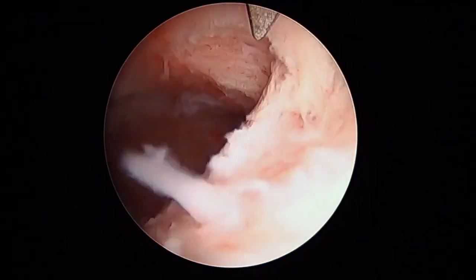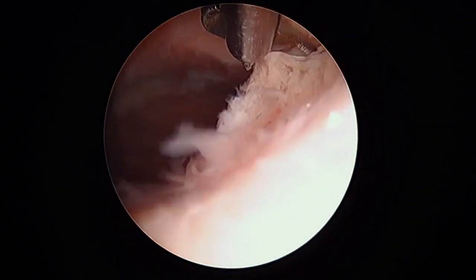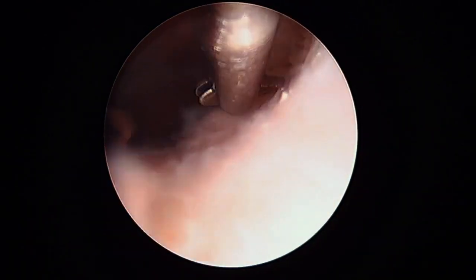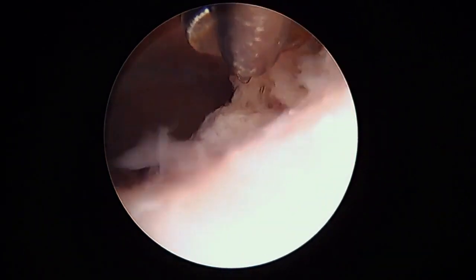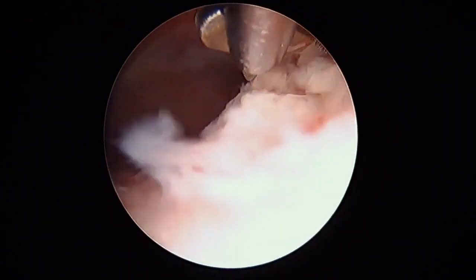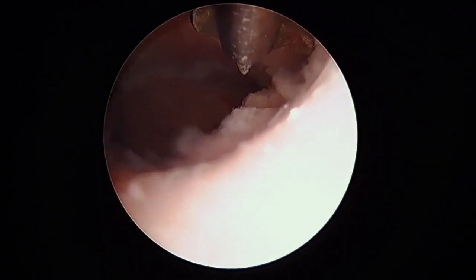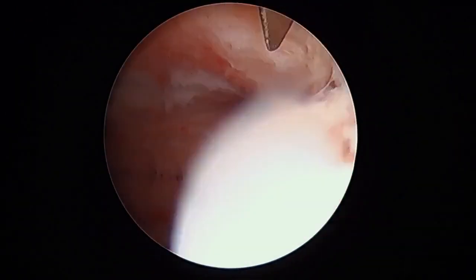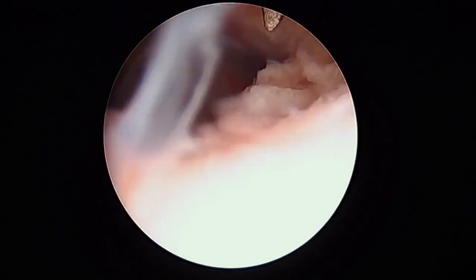Finally, a complete survey of the endometrial cavity revealed further scar tissue in the mid-uterine cavity on the left side, which is taken down with hysteroscopic scissors, as can be noted here.